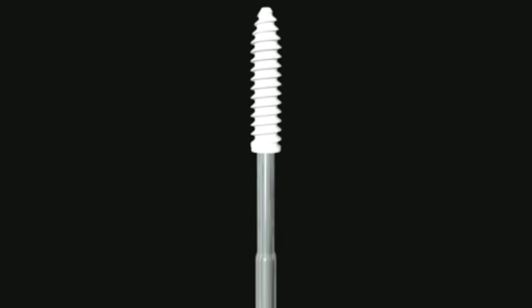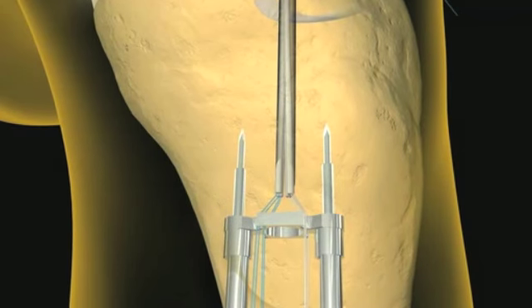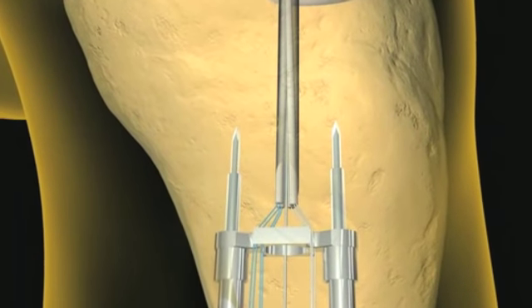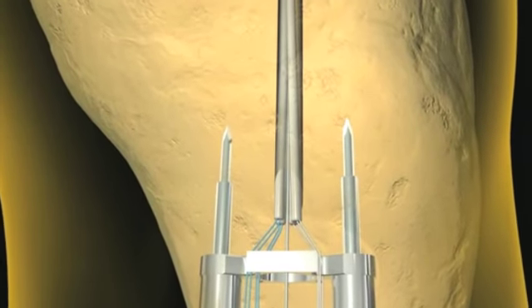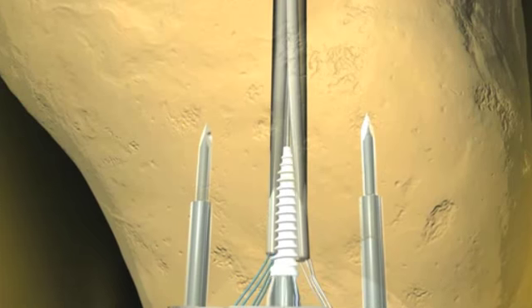Next, load the appropriately sized matrix interference screw onto the tri-lobe driver. Ensure that the knee is in 15 degrees of flexion. Advance the Linvatec BioScrew Hyperflex guide wire into the tibial tunnel and in the center of the 4 graft bundles. Load the matrix screw and driver onto the guide wire and advance it through the tensioner and into the tibial tunnel until it is flush with the external tibial cortex.